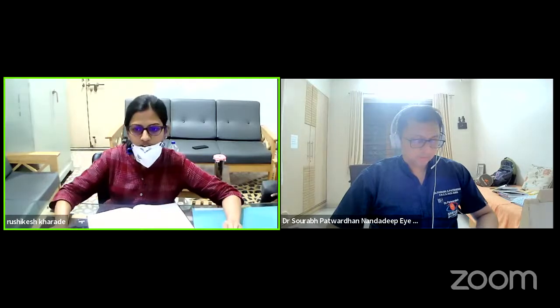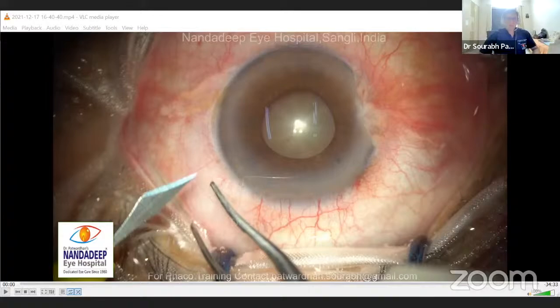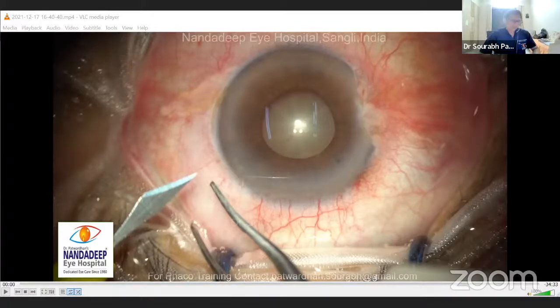In this one case, I'll show some. If the irrigation is directed below the iris or directly against the iris, then it can become slightly floppy. Or maybe the pupil itself is smaller, like in this case, where I think the pupil was small when we started. In those cases it happens most of the time. If the pupil is mid-dilated, it is prone to becoming smaller during the procedure.